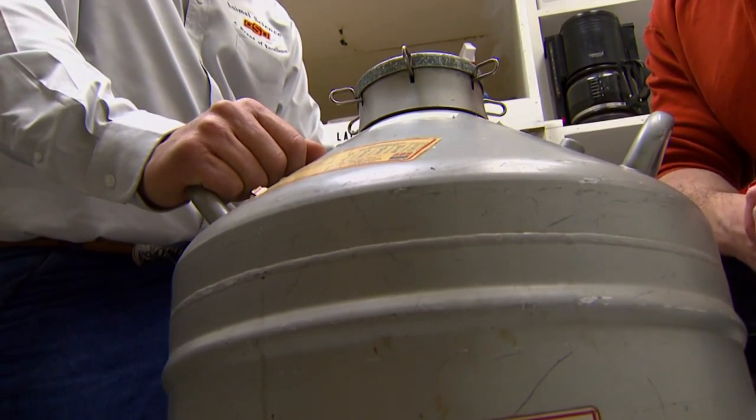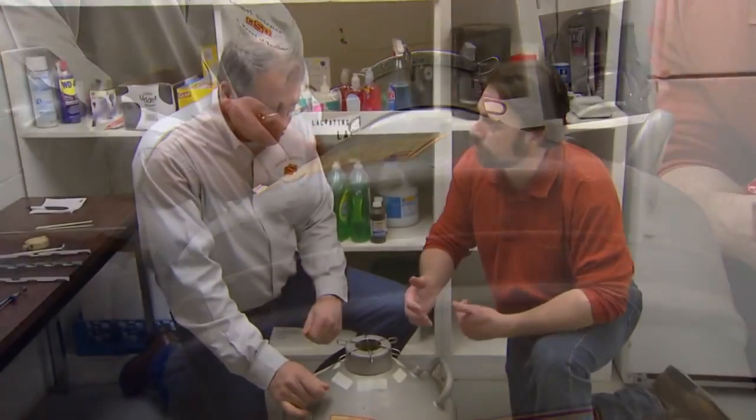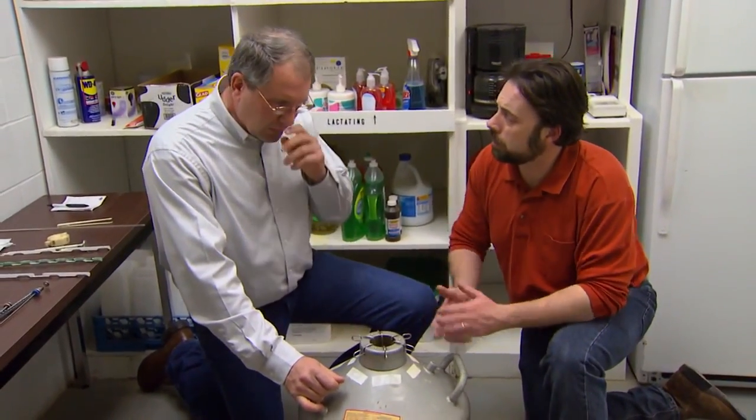So now let's talk about common problems people have here. What do you hear most from folks if they call you, say, hey, I'm having trouble with my tank? Well, when I get a call from somebody that says, look, my percentage this year was just not what I've had in the past, I go back to the very beginning on what might be going on, and I start at the tank as far as how they handle their semen. It may not be the technique in the cow, it may be before they get to the cow, and that's the place I start.